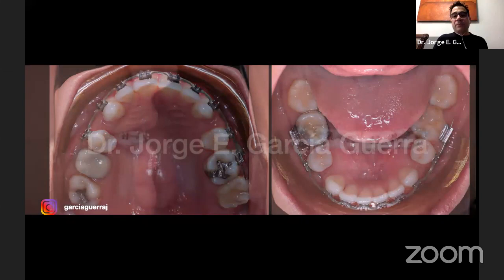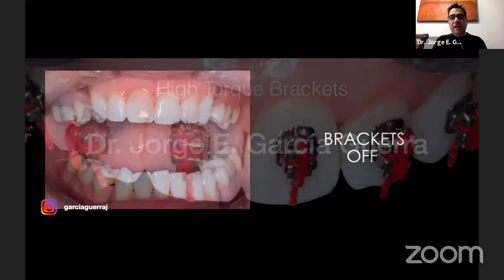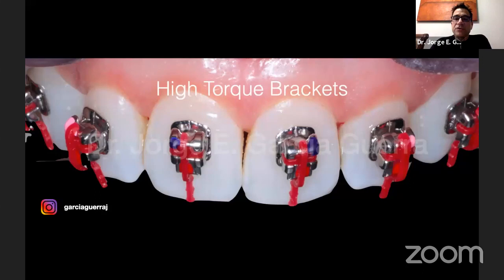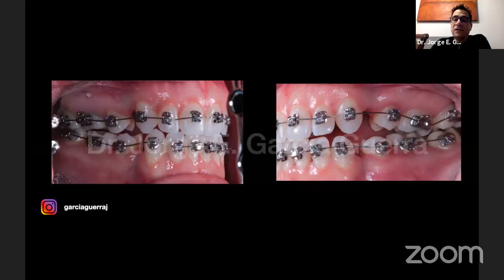What I always do, take the brackets off, we wait about a month, so they always have some relapse. And we put some brackets, high torque brackets, to help us with the space closure. And we start leveling and aligning to correct at the beginning. I'm gonna go a little bit fast because you can see this effect on the side.